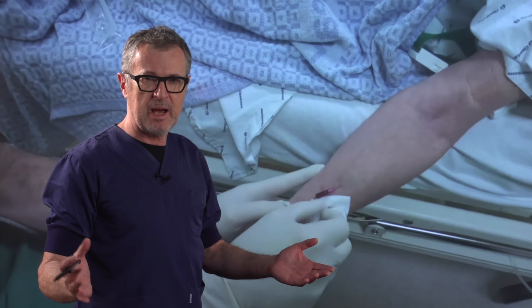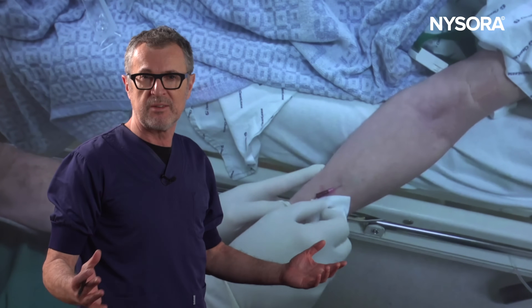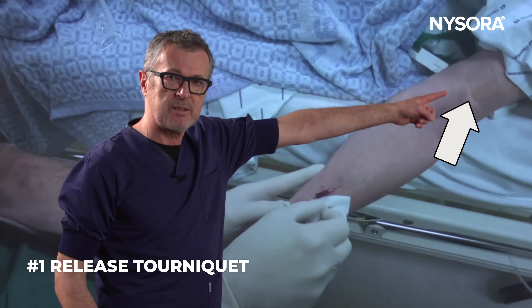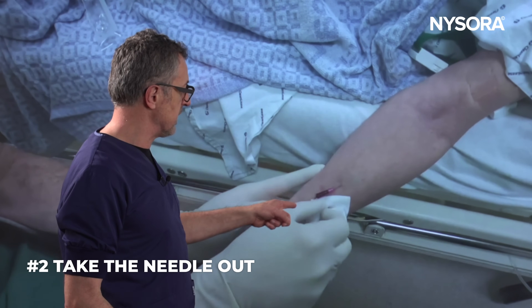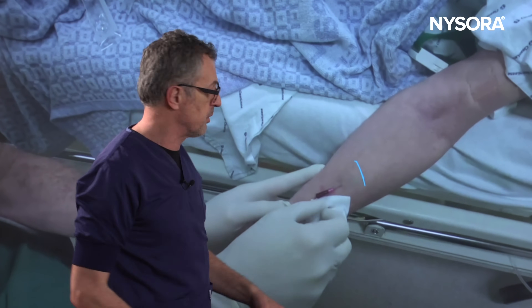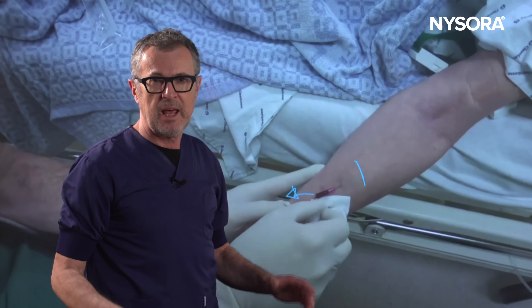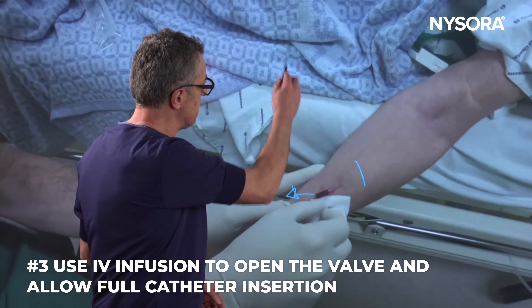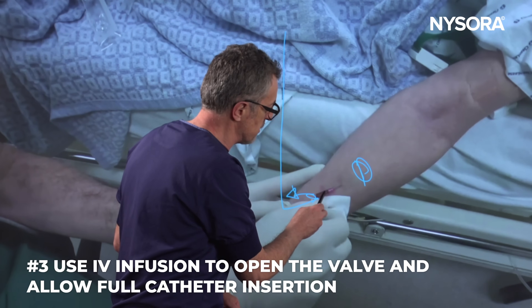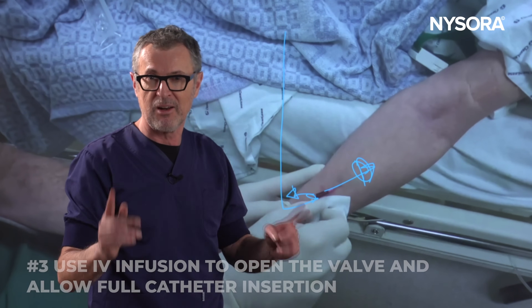So what do we do when the catheter tip is obstructed by a valve and we cannot advance it fully into the vein? Here's the strategy. Number one, we're going to release the tourniquet. Number two, we're going to take the needle out while obstructing the vein with our thumb or a finger so that we do not get too much backflow. And number three, we're going to connect the IV to the vein and run an IV infusion to open up the valve so we can advance the catheter deeper into the vein.